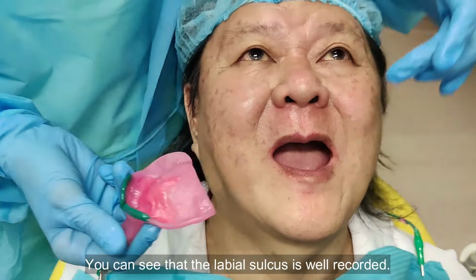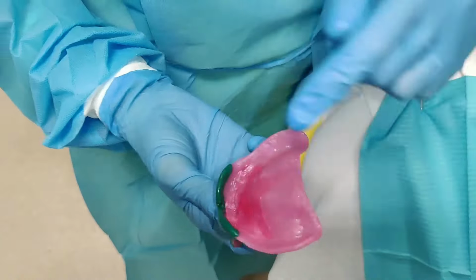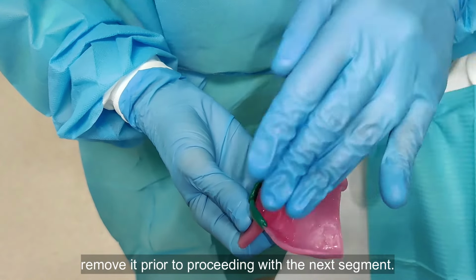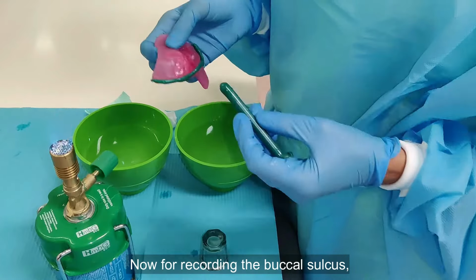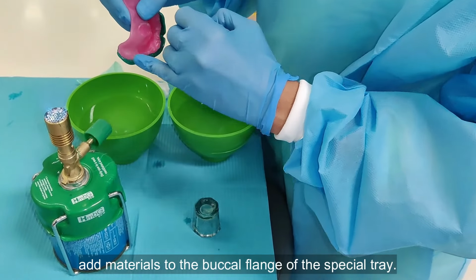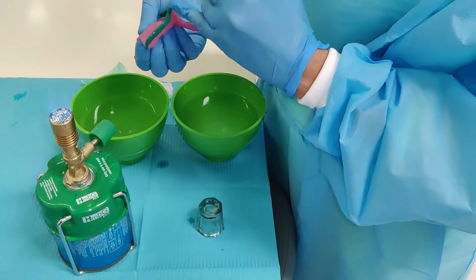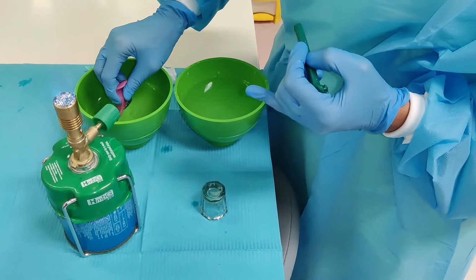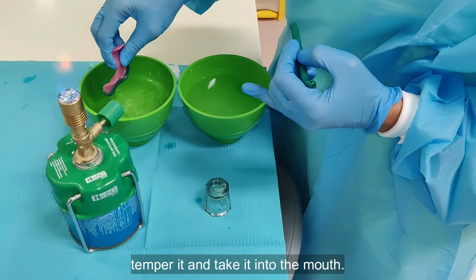You can see that the labial sulcus is well recorded. If any material flows inside the tray, remove it prior to proceeding with the next segment. Now for recording the buccal sulcus, add material to the buccal flange of the special tray. See that the segments do not have any discontinuation. Temper it and take it into the mouth.